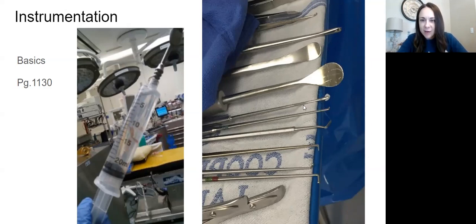After that, I'm going to skip over to this instrument right here. Hopefully you see that little piece on the ends. That is some bone wax. So this looks like from the Rhoton set. So it's very small for microsurgery, but there's a little piece of bone wax on it. That's because as soon as they get in there, even in microsurgery, some of that bone will still be bleeding, and that's how they're going to apply the bone wax to the bone. So they're going to put it on the end of an instrument and then rub it onto that bone to stop the oozing, the bleeding.